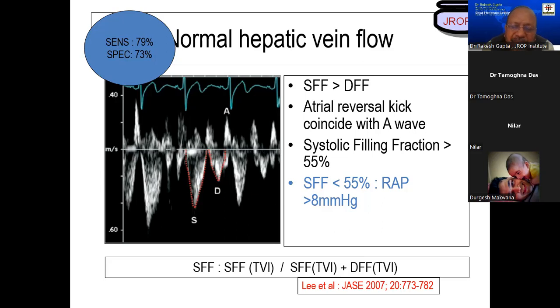As said previously, if my IVC size is less than 13 millimeters, or 12 millimeters, then we are volume deficit. And if the IVC is loaded, more than 21 millimeters in size with less than 50% collapse, it means we have a volume overloaded patient presenting in shock state.